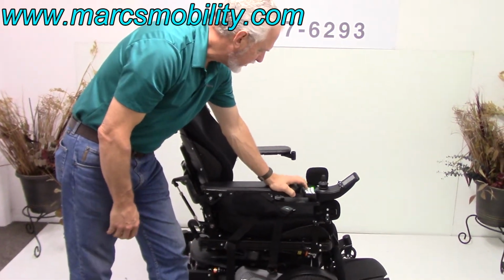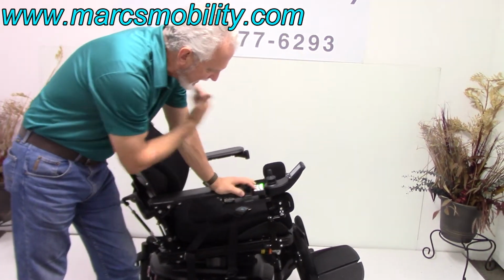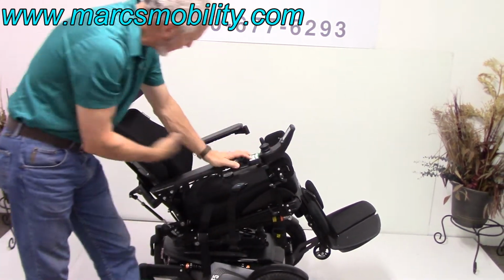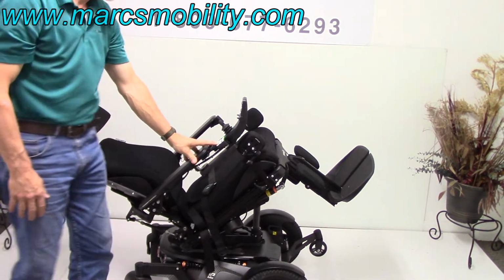The next feature we're going to cover is the electric tilt. What that is, that's the third electric feature. That's the back, that's the bottom here tilting back. Of course, the back is going to go out back at the same time. That's called your electric tilt. Okay? That's the electric tilt.